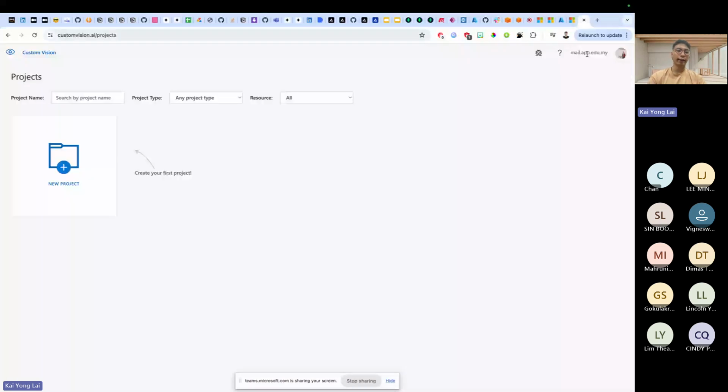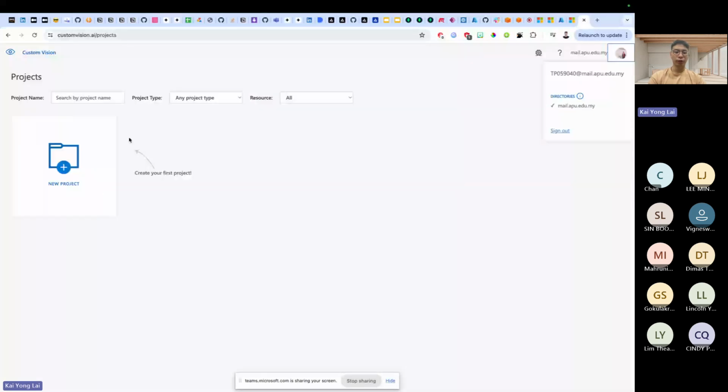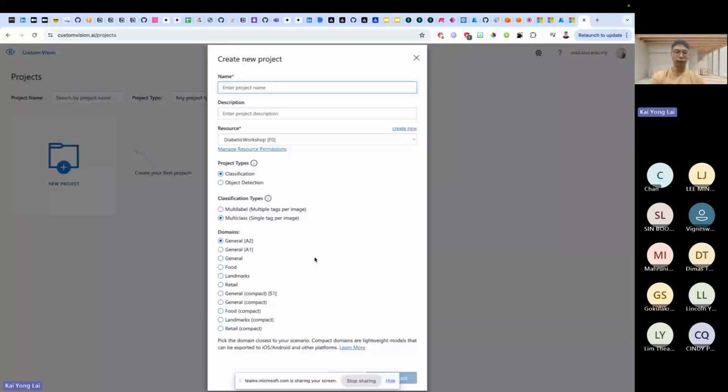Okay. So once you're at this page, customvision.ai/projects, just click on new project. Remember to log in with the same account that you are on in Azure. All right. So just click on new project. And then at this end, classification, correct, multi-class, General A2. And the project name itself, we are going to go with Diabetic Workshop. Okay. So once this is done, you just need to click on create project.